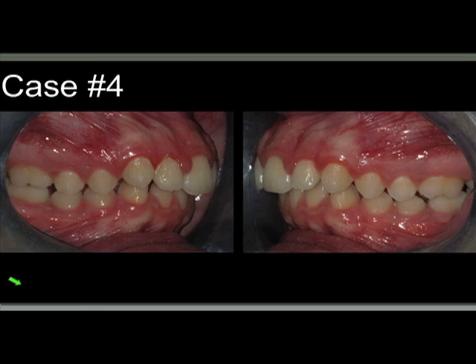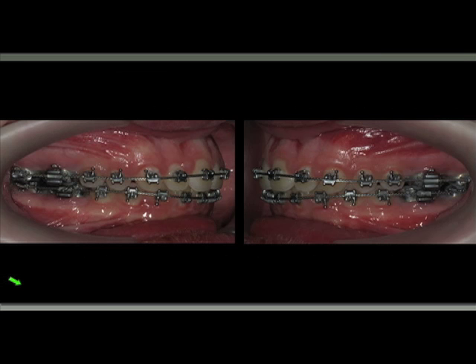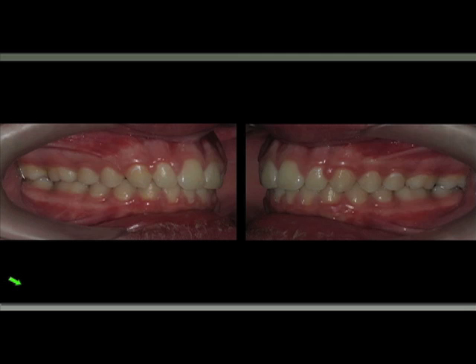You can also see a case like this, a full class 2 that I treated with an expander and some class 2 orthopedic treatment. You can see this is the initial photograph. That's the final arch wire. And you can see over here the final result.